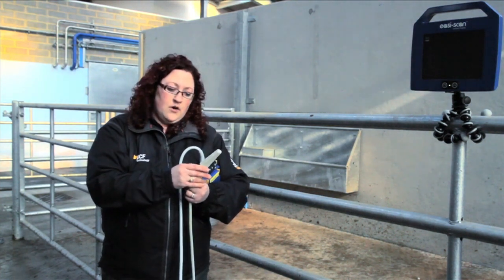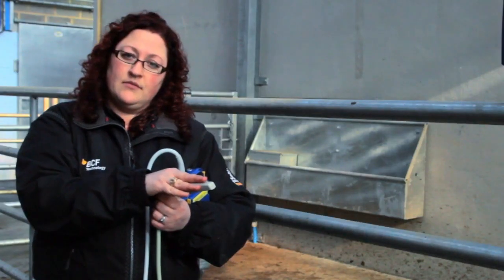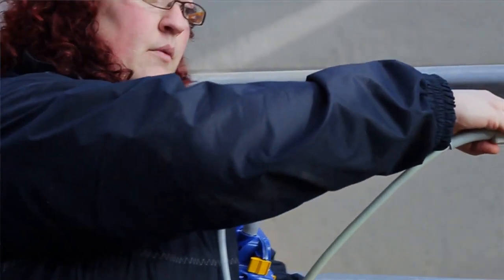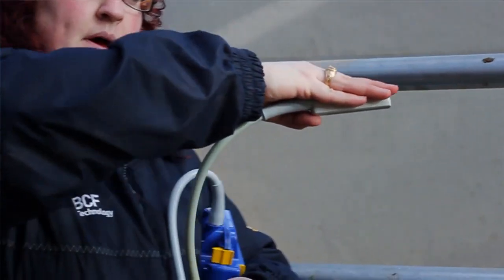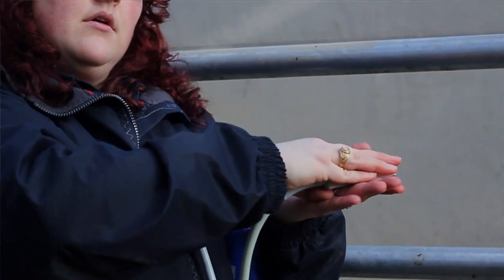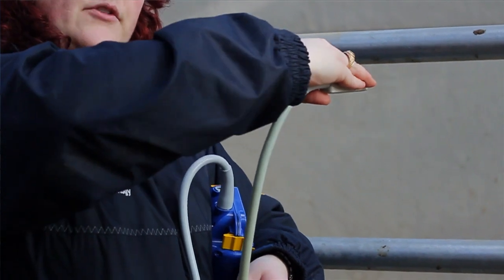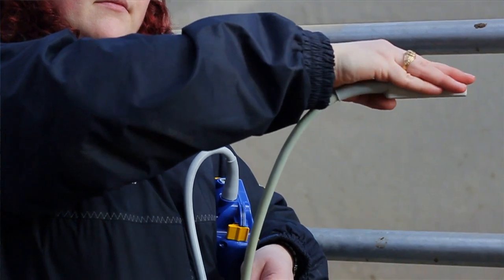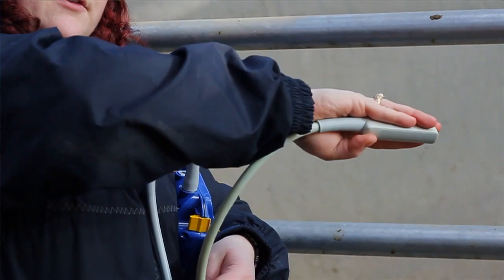We can also alter the way that we manipulate the probe when it's inside the cow. And the 4 movements that we can make are either moving forward or back, adding pressure to improve contact, we can rotate from side to side, or we can rock or tilt the surface of the probe.